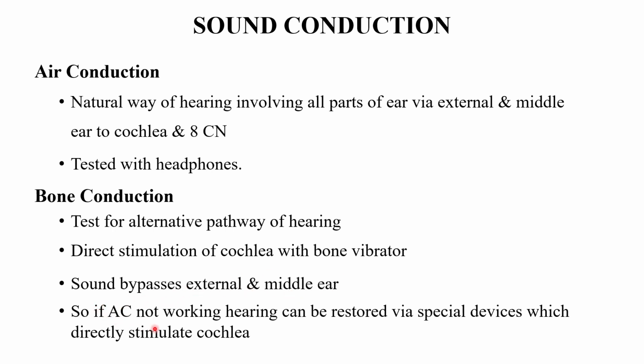So in certain cases, if air conduction is not working, hearing can be restored via special devices which will directly stimulate the cochlea.